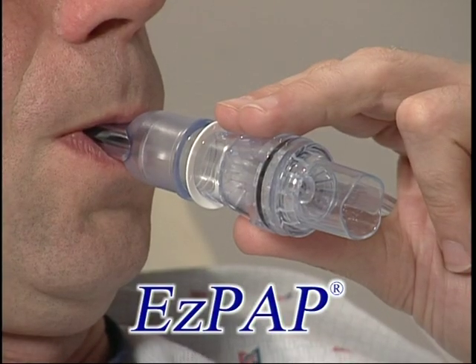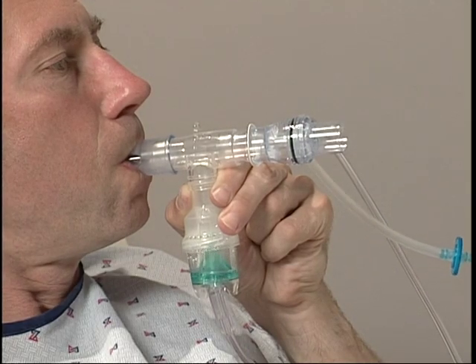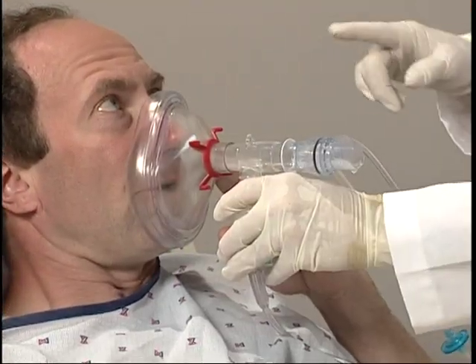Hello. In the next few minutes, you'll learn about DHD's EZ-PAP, whether you're considering it as part of your respiratory care program or because you've already instituted its use. EZ-PAP is a device indicated for use in lung expansion therapy and the treatment and prevention of atelectasis. EZ-PAP may be used with a nebulizer and is available in various mask sizes.